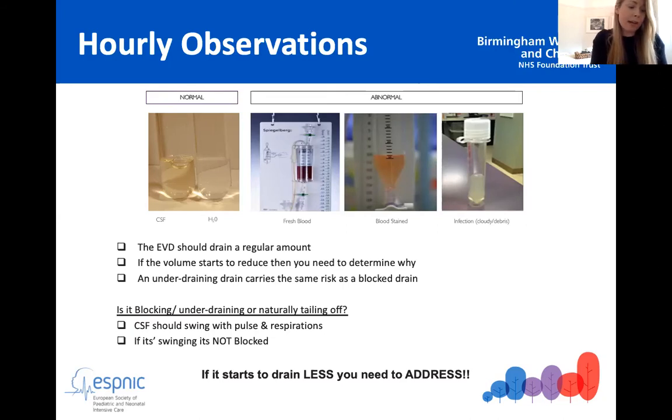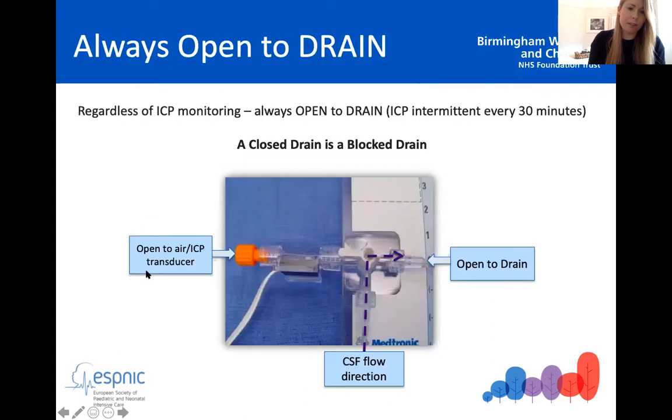And so it really makes the use of the device much higher risk, because it's not something that's commonplace on intensive care. And so when a patient arrives from theatre with one, I might be faced with nurses and registrars potentially that haven't seen or used an EVD in 6 to 12 months. And so having this consistency in your approach is really, really important.